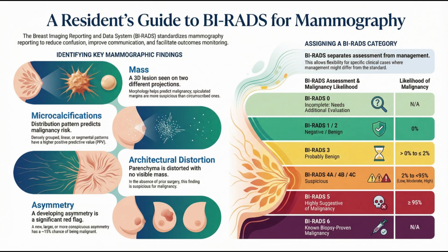Okay, what about other specific non-mass findings that get their own descriptors? A really common benign one we see is a normal intramammary lymph node. This will look like a well-circumscribed, maybe slightly lobulated mass, less than a centimeter. The key diagnostic feature is the radiolucent cleft. And that cleft is basically fat in the center, which tells you it's benign. Yes, exactly. The fat in the hilum of the node is a very reassuring sign of normal structure, and they're usually in the upper outer quadrant, which is the normal drainage path.